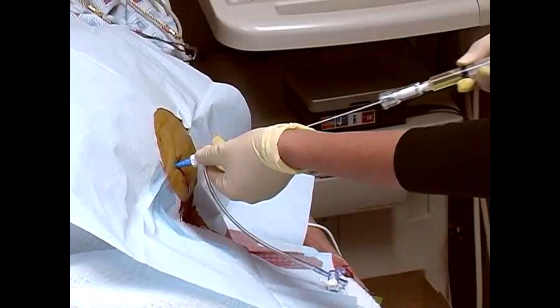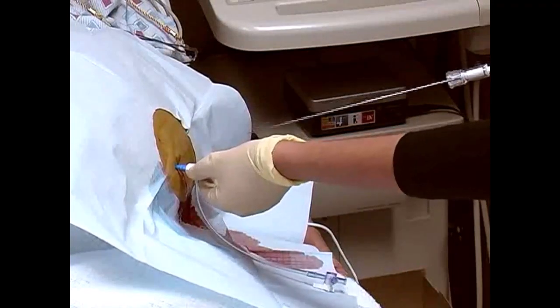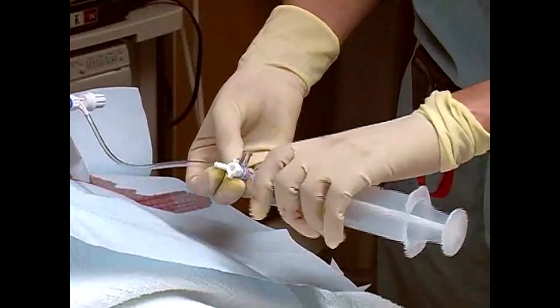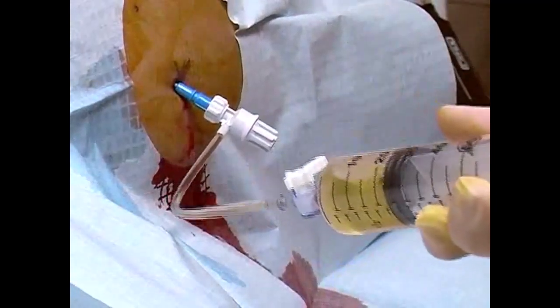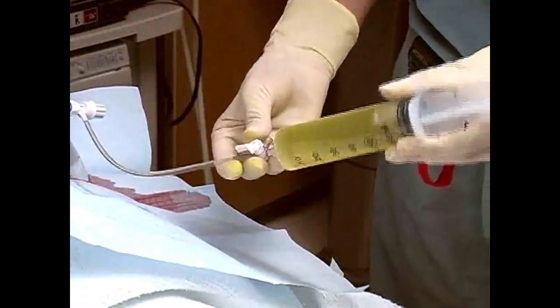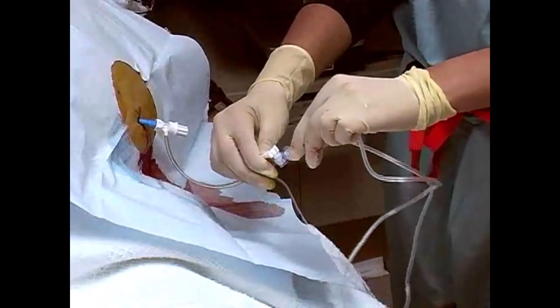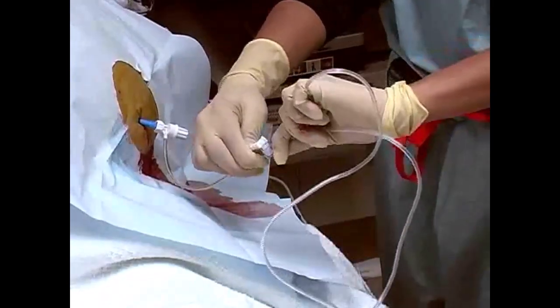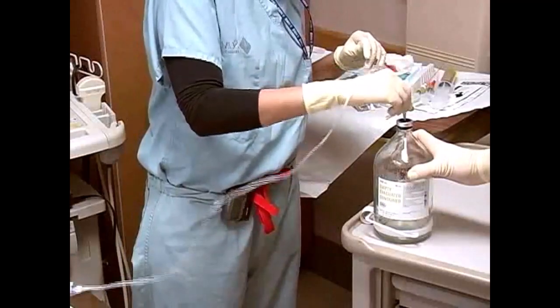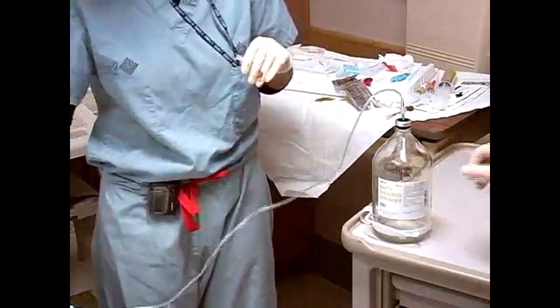Then remove the needle from the catheter. Attach a large syringe to the paracentesis catheter and withdraw 30 to 60 milliliters of fluid for diagnostic analysis. Once fluid collection is complete, detach the syringe. If additional fluid needs to be removed for therapeutic purposes, attach high-pressure drainage tubing to the catheter and then insert the other end of the tubing into an evacuated container.